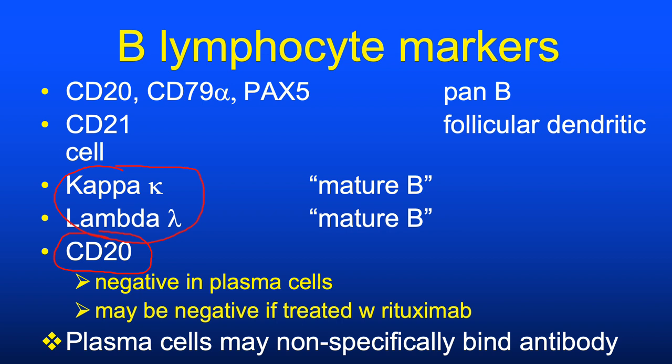Plasma cells are chock full of immunoglobulin—the same protein used as the primary and secondary antibody in immunoperoxidase stains—so if you see nonspecific staining in cells that morphologically look like plasma cells, it's probably nonspecific.